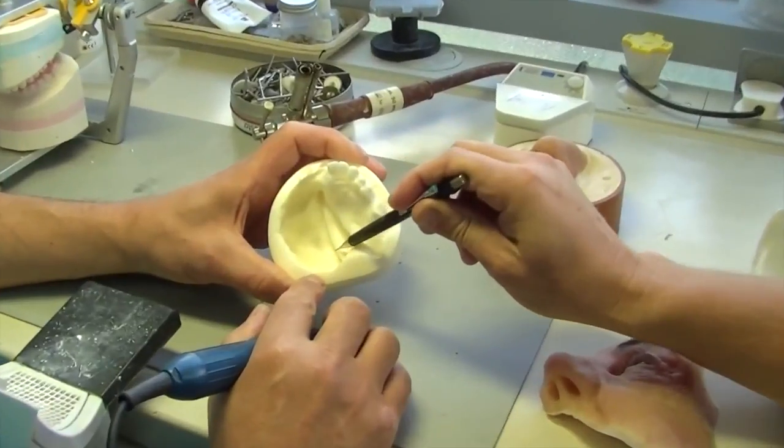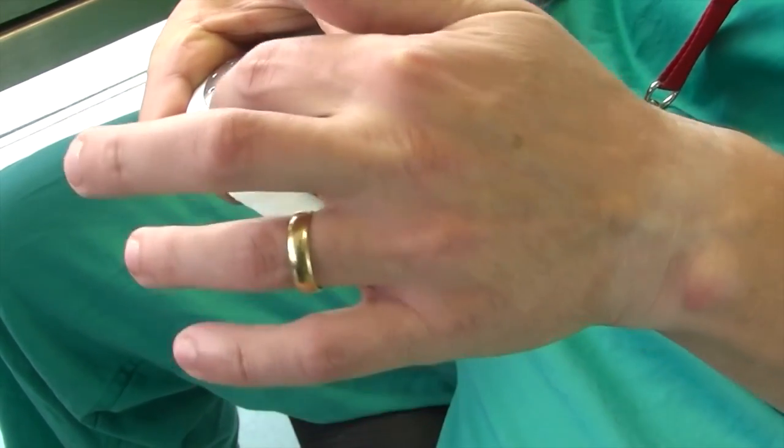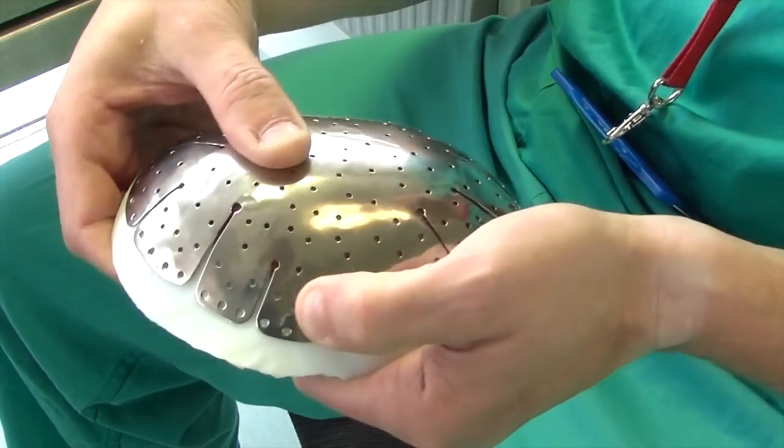And from there, if surgical plates, titanium plates that are used at the time of surgery to hold those bits of bone in the correct place with the surgeon, we can adapt those. We can screw them onto the model if we wish. We can screw them on and hold them there, or we can purely just adapt them on, but it won't affect the model in any way.